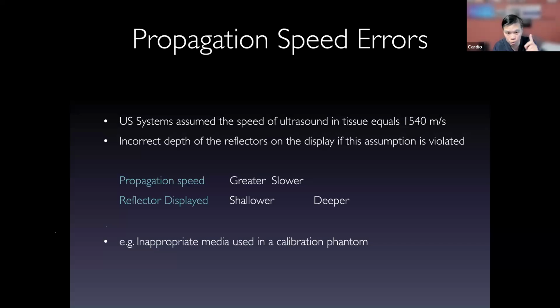But the good news is we don't necessarily calibrate it anymore. I did try to ask the ultrasound vendor why they don't need to calibrate with the phantom anymore, because when we were young, we used to do studies on phantoms by looking at the lateral reflection and the lateral resolution on ultrasound and things like that. But they just say, we don't do that anymore.